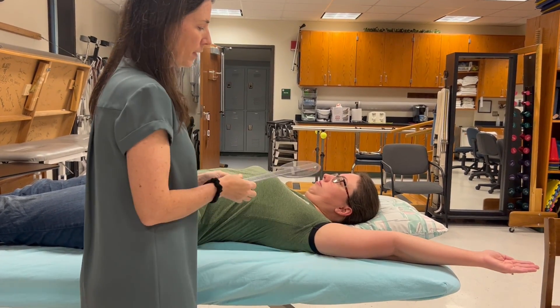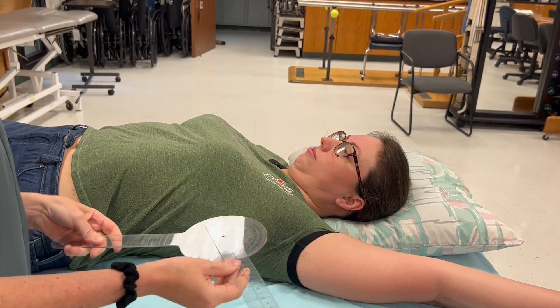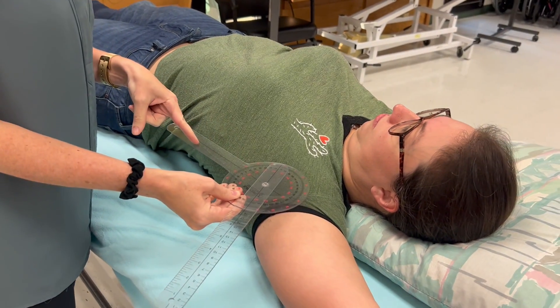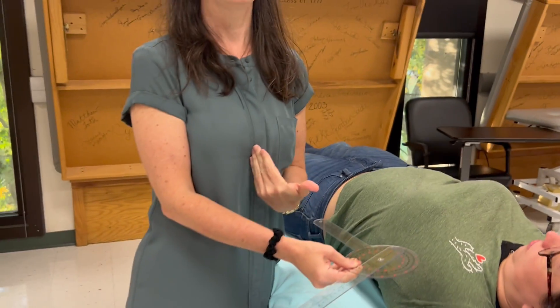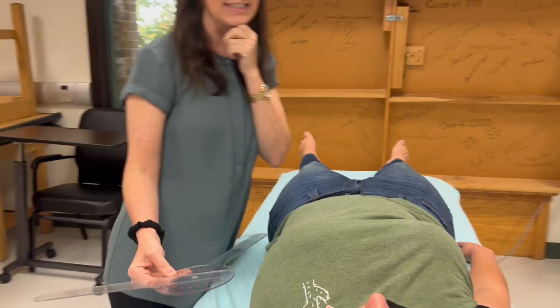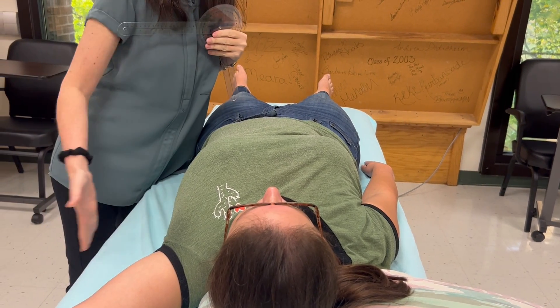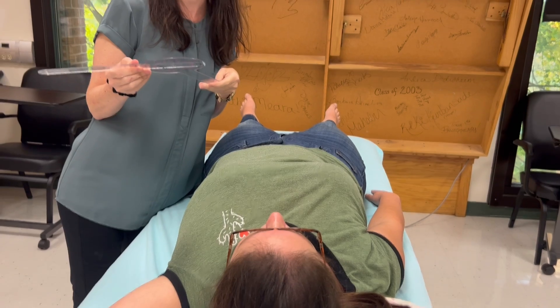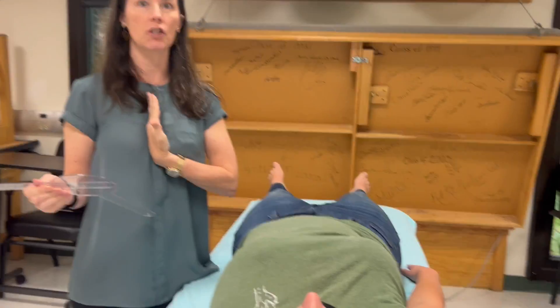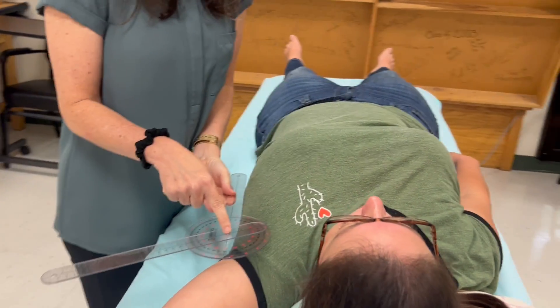Abduction occurs in the frontal plane, which means my goniometer has to be moving in the frontal plane as well. The fulcrum goes right over the axis of motion — pretty much right over the armpit. The stationary arm is going to be lined up anterior to the midline of the sternum. Standing at the head of the bed is the best place to see the orientation of the sternum, which isn't necessarily parallel with the side of the bed. We're not going to palpate the sternum or put our hand there — we keep our hands free of that area. I'm placing the fulcrum basically right over the armpit and making sure the stationary arm is parallel with that anterior midline of the sternum.